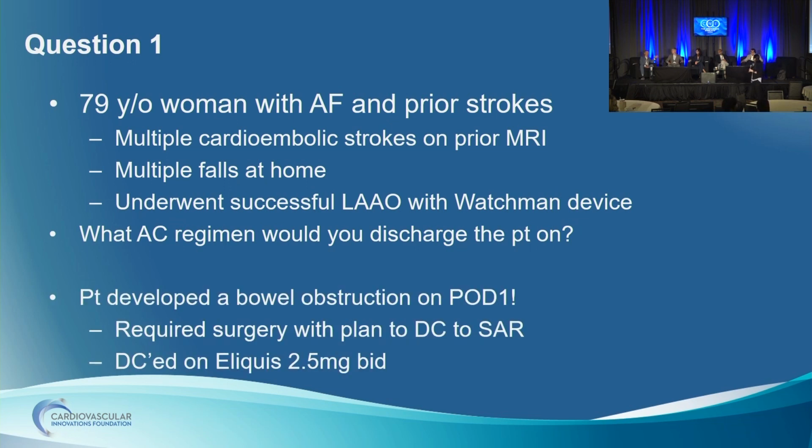I would give 6 weeks of Eliquis, DOAC monotherapy. I didn't think CHA2DS2-VASc score on this patient. It was elevated. She had a stroke before. It was about 6. Was she in sinus or atrial fibrillation? She was in permanent AFib, so there was a lot of surface area on that device. It's a large device.